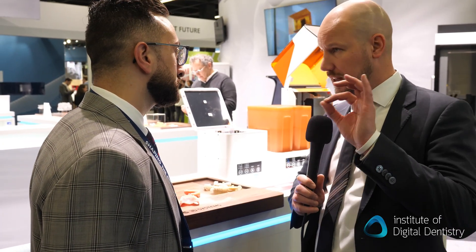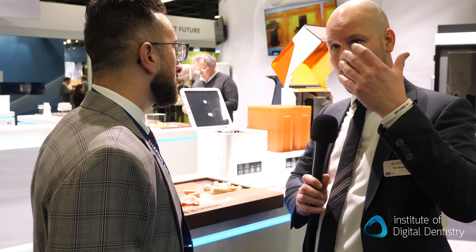With the new printer, are all the NextDent resins available? Yes, absolutely. All the NextDent resins are available on the printer preset. You just select them in the software — if you want to do a model, a base, or crown and bridge work, you select the material and go straight to printing.